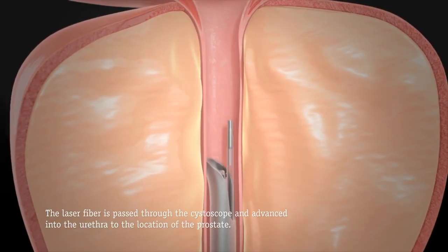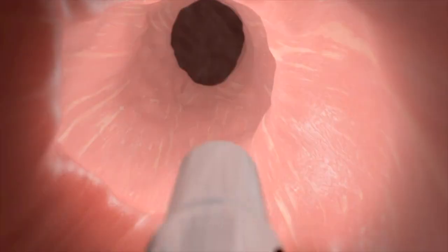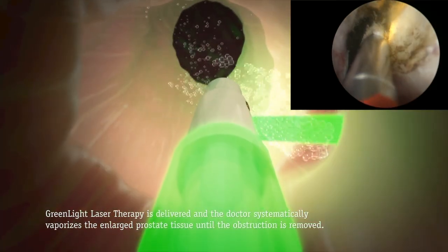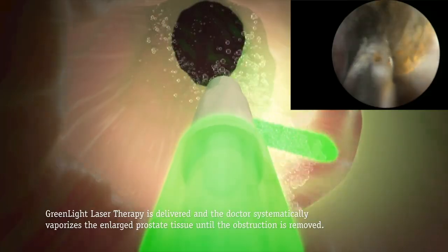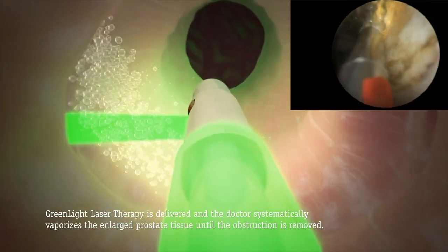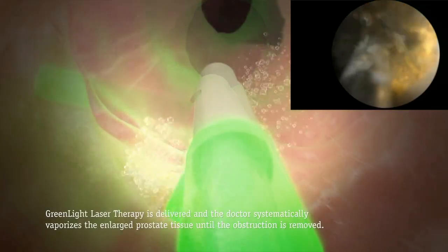What we actually do is we superheat the tissue, and most cells are made of mainly water. If we superheat that tissue, it causes the water to boil away. You see on the animation the little bubbles — those are boiling little bits of water and tissue that we then suck out through the scope.